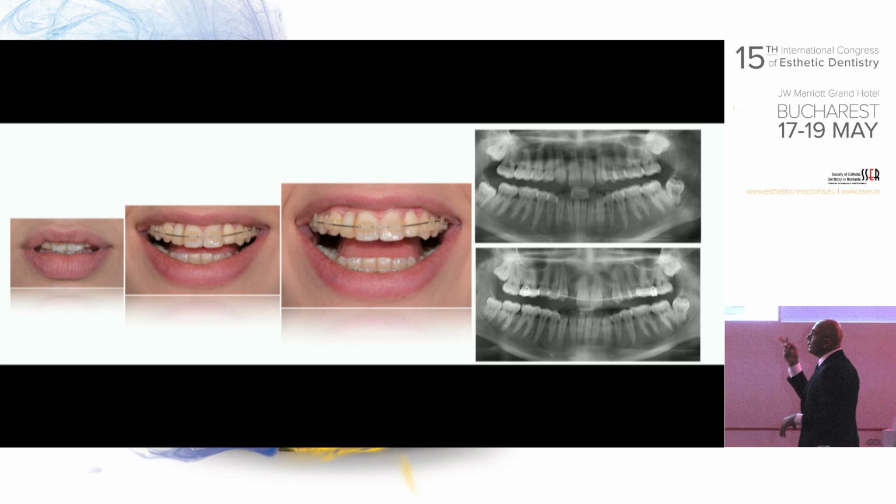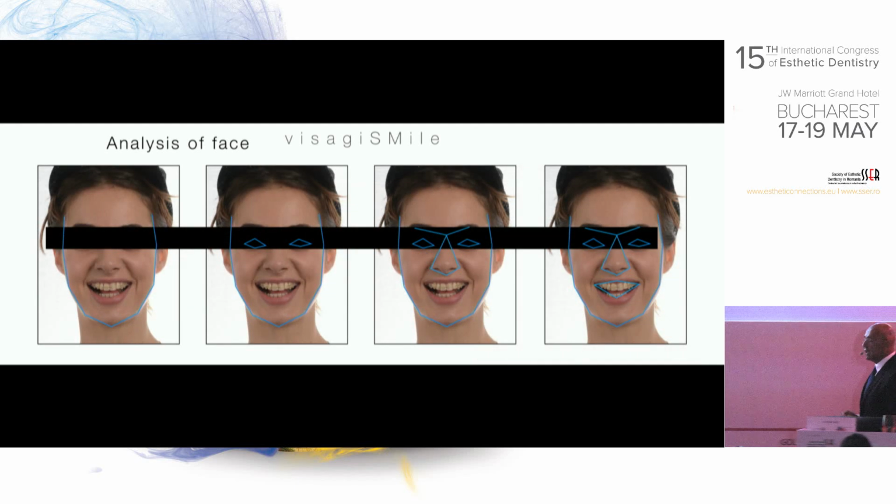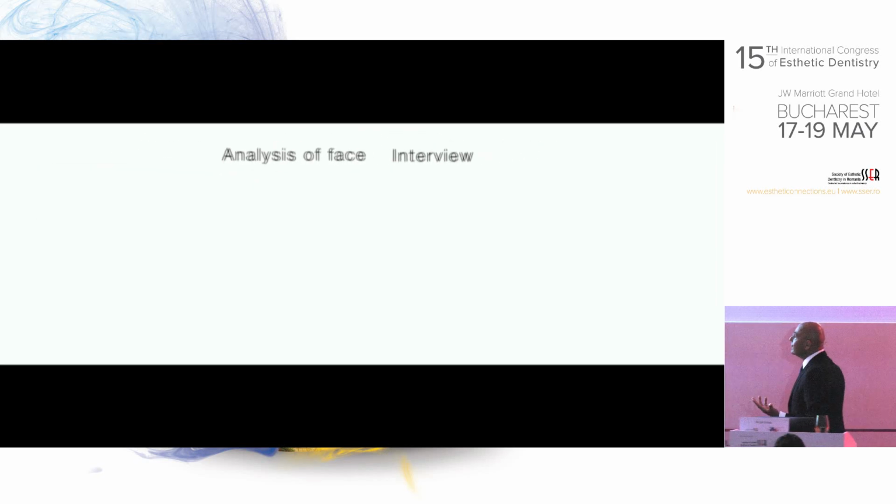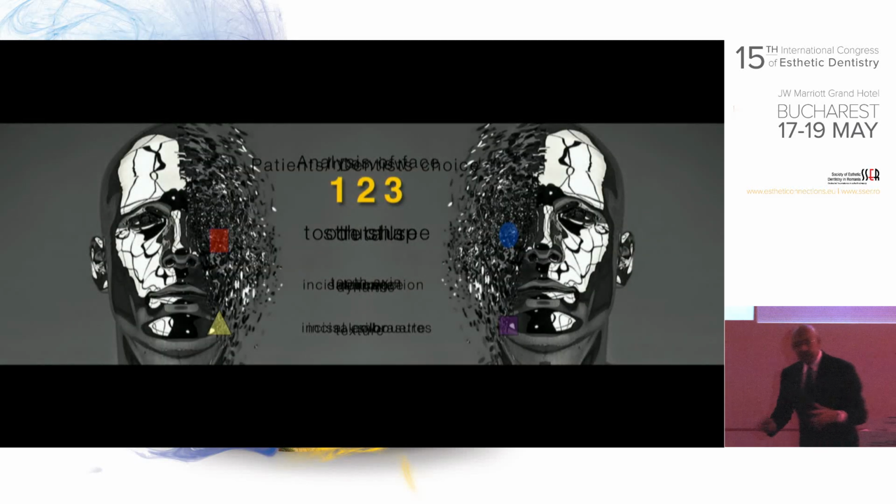And then we decided to go, okay, let's see what we can do at this stage. And immediately we make the pictures, even if the patient had braces, put it into the Visage Smile program, went through the interview, and then that gave me the design.